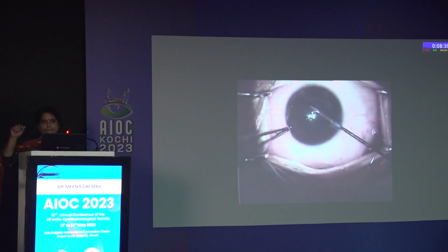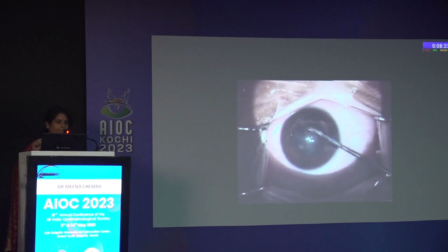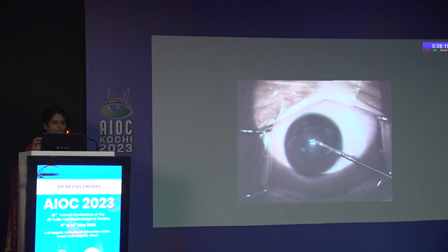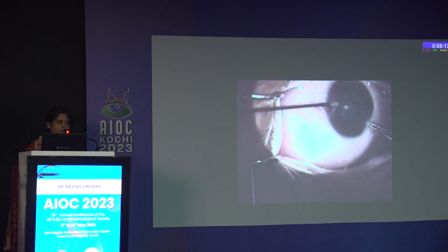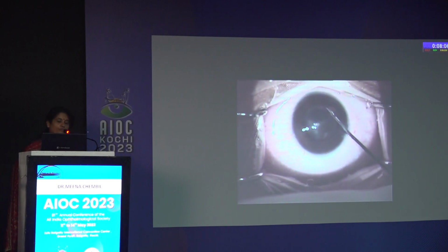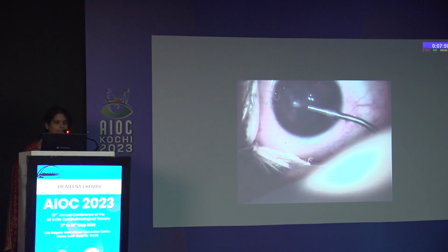You have a pointer. Simple microphthalmia. You can see a small coloboma there, but it's an incomplete coloboma and it's not creating any problem for your surgeries. So each step is a little different in microphthalmia, because when you feel that there is some problem with your rhexis, like you can't pull it properly, then you shouldn't try to do it, because you can have a microphakia associated with it. So then you can convert it slightly with micro scissors and then continue with this.